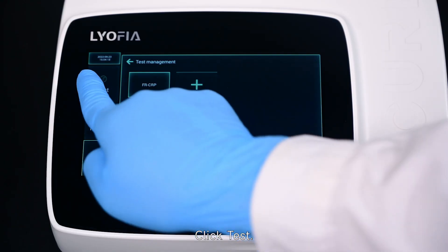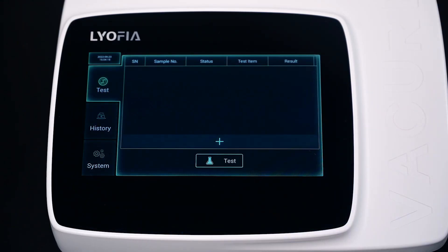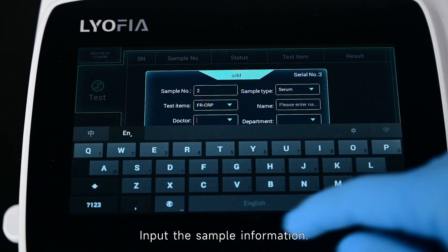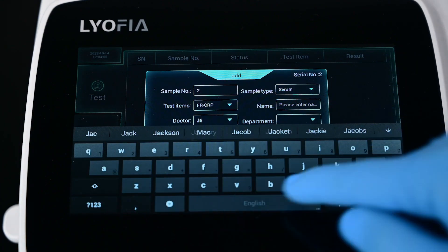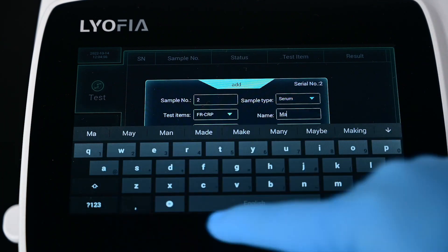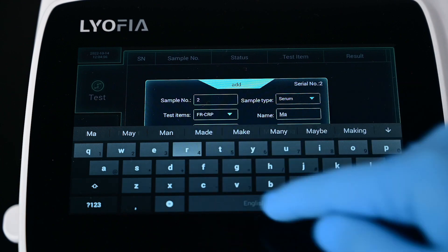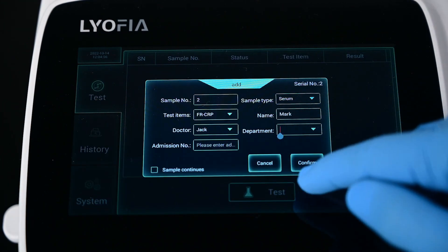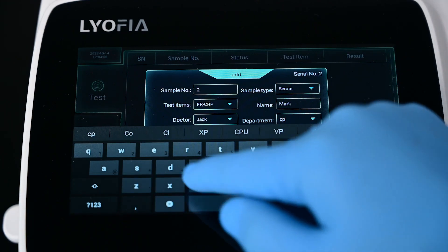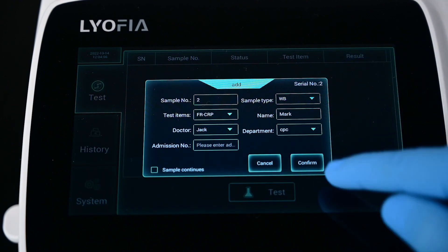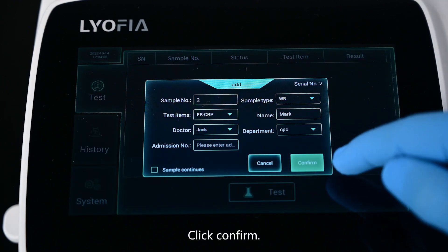Click Test. Click the plus button, click plus again, and input the sample information. Click Confirm.